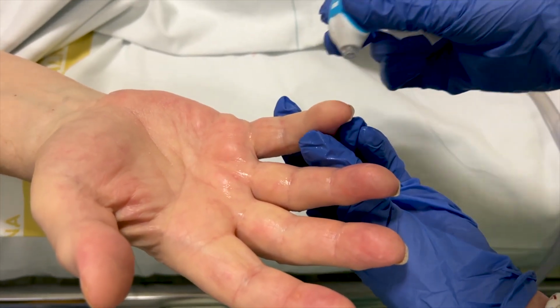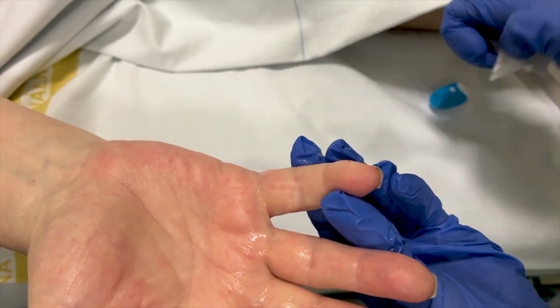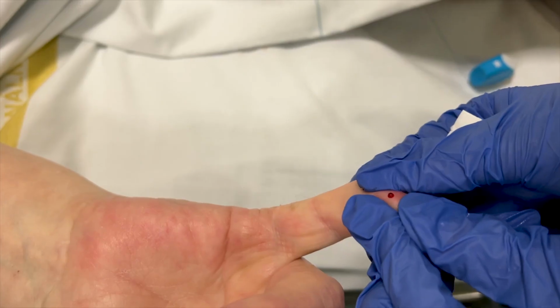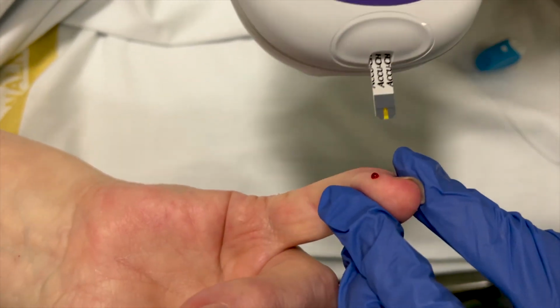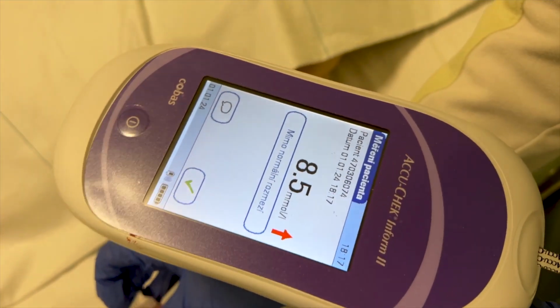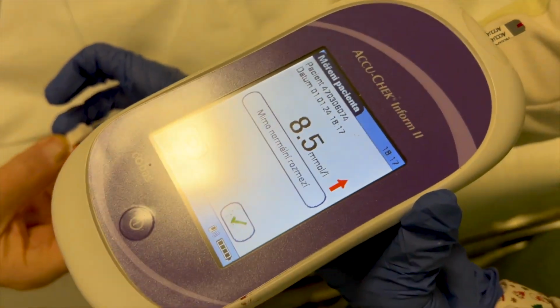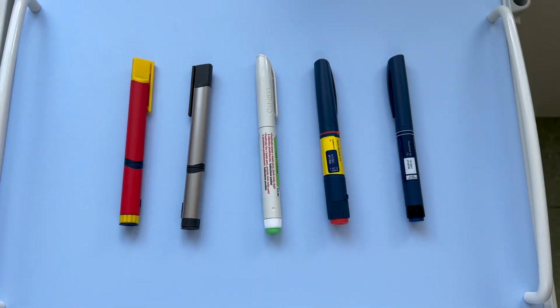Before administering insulin, a blood sample is taken from the patient's fingertip to measure the blood glucose level, glycemia. Based on the measured value, the appropriate insulin dose is prescribed by the doctor. Normal fasting blood glucose levels from capillary blood are typically around 4.0 to 5.5 mmol/L (Bg-C).